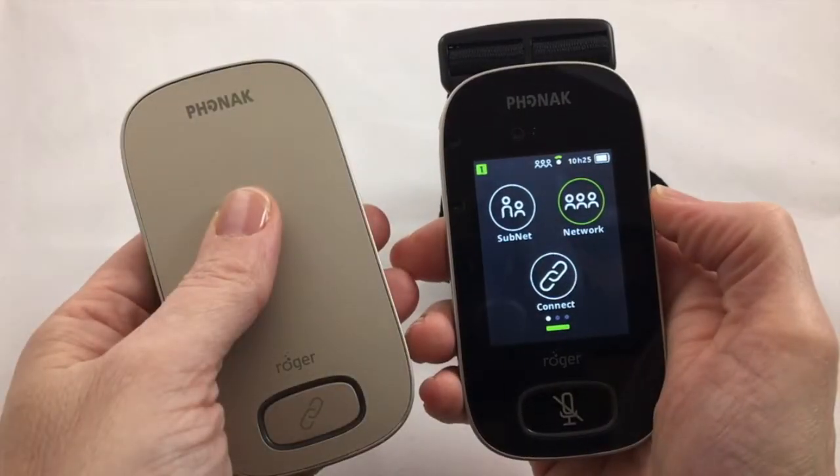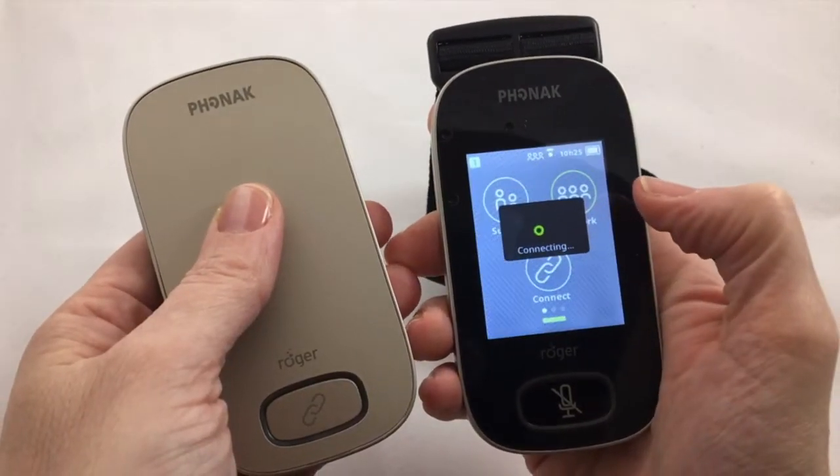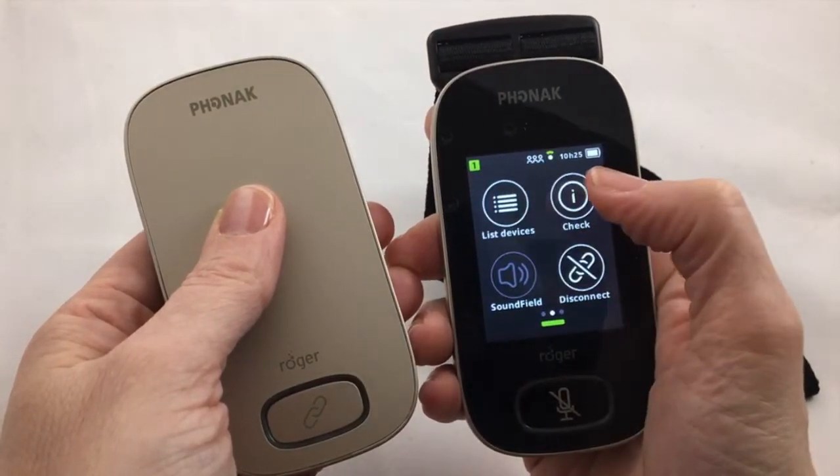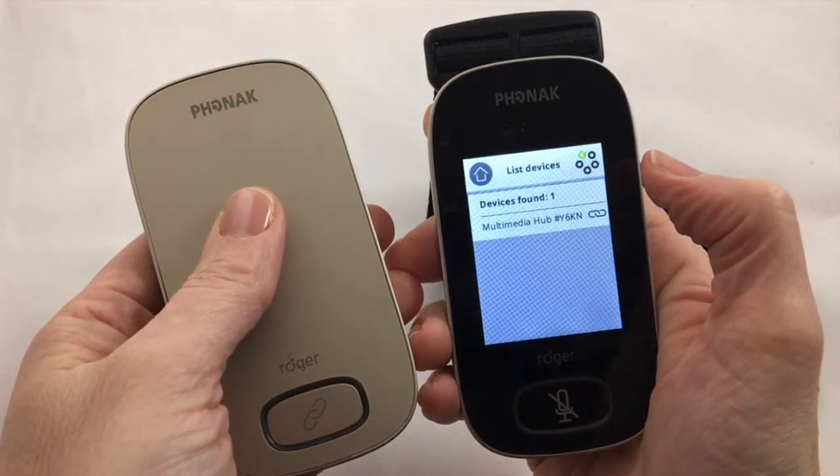To connect, place the Roger touchscreen mic within 4 inches or 10 centimeters of the Multimedia Hub and touch the Connect button. To check if you're connected, you can always press the List Devices button on the second page.